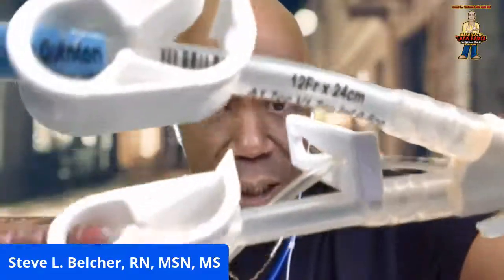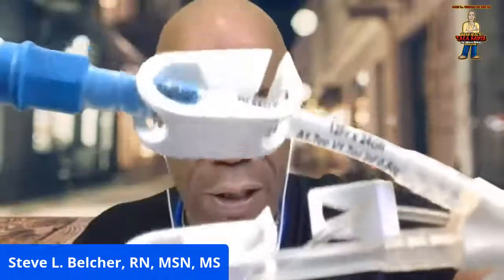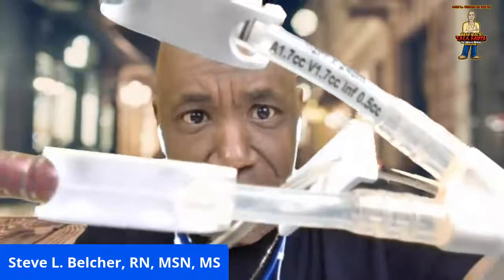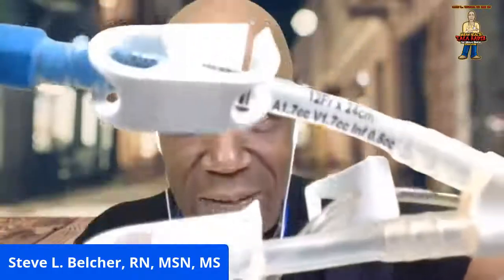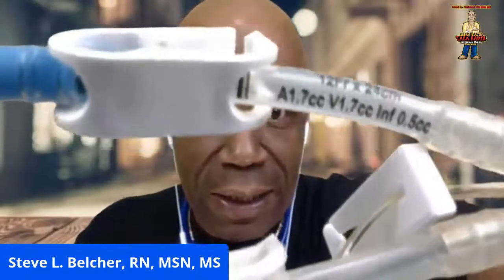You see where it says 12 French, 12 F times 24 centimeters. That's the length of the catheter. But when you look right there, it says A 1.7 cc's, V 1.7 cc's. Can you see that right there? You got A 1.7, V 1.7 cc's. That's how much you instill in the catheter in each limb.